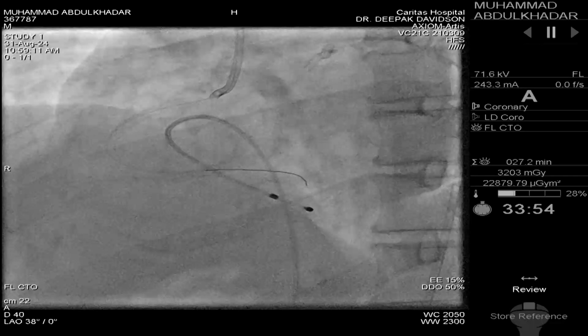Anisha, the 3 millimeter balloon. And we wouldn't be further more aggressive at that particular area because it's a nodule over there. You can end up having a perforation over there. So we would go with a 3 at 22, 24 atmospheres and we are done with that.